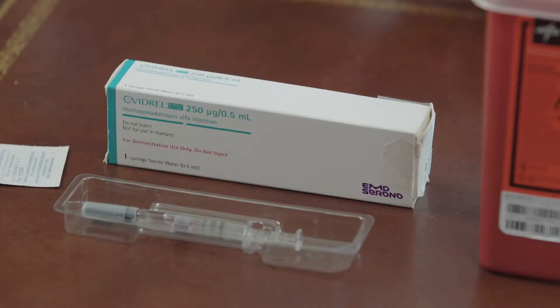For your injection you are going to want to wash and dry your hands and prepare your injection in a clean dry environment. You will need your pre-filled syringe full of Ovidril already loaded to the dose you need, alcohol swabs, and the red biohazard box.